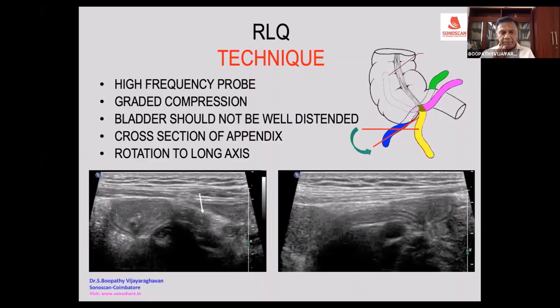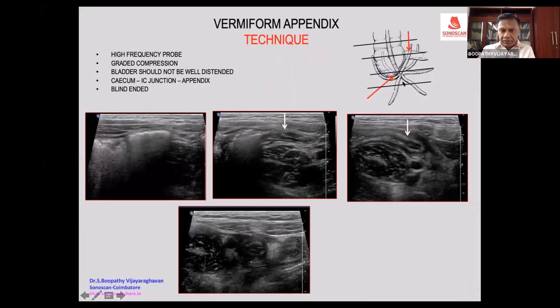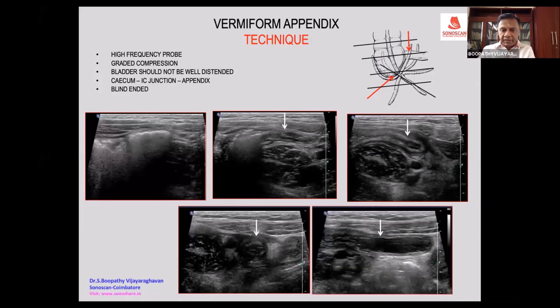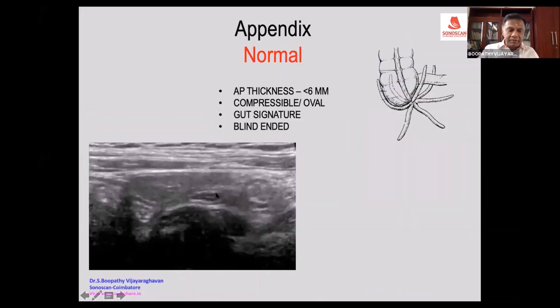With graded compression, in many patients you will pick up the cross-section of either the normal or the abnormal appendix. You can then rotate to see that the appendix is below the cecum. You will see the cross-section of the appendix, and once identified, rotate the transducer to look for the gut signature, because the appendix is also a part of the bowel.